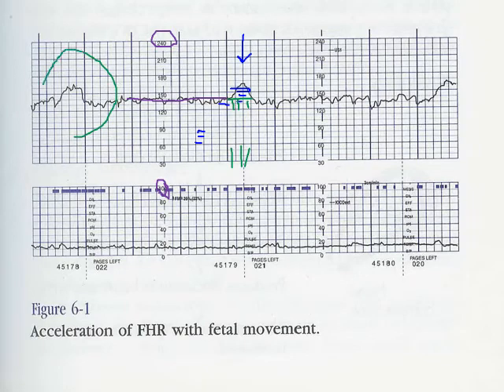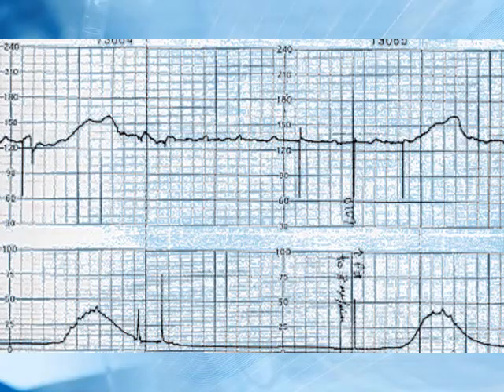Come over here and on your own, figure out whether that acceleration is meeting the same criteria. And you should say yes. Now you tell me, well, you can't tell me, I'm on video again, but tell yourself, is this an adequate acceleration? Is that an acceleration by definition?